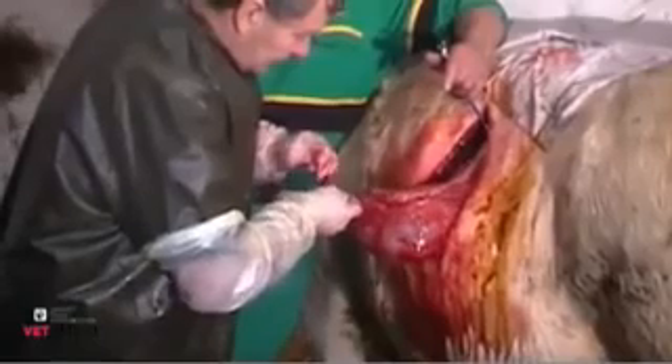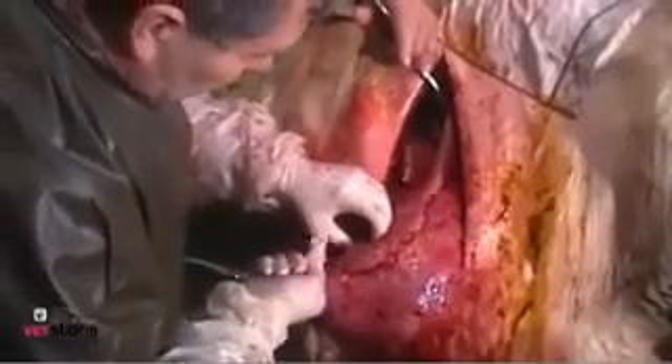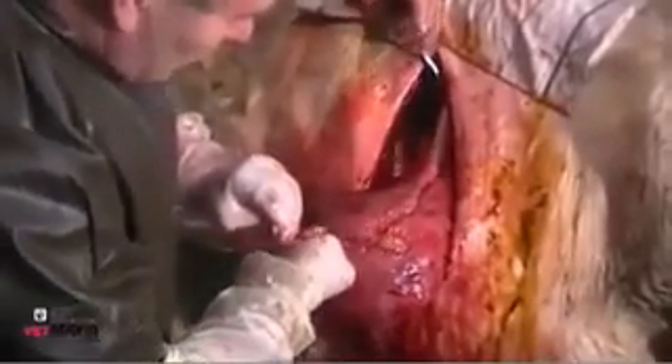It is now time to stitch up the uterus and it needs to be sutured in two layers. Here we can see the second layer of stitches being applied. This ensures that there won't be any leakage from the uterus inside the abdominal cavity.